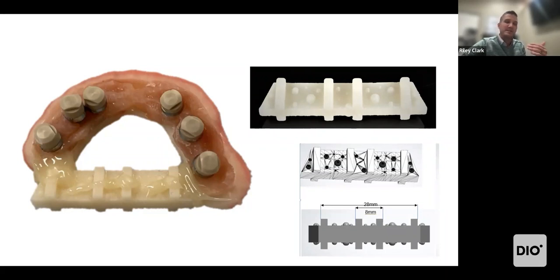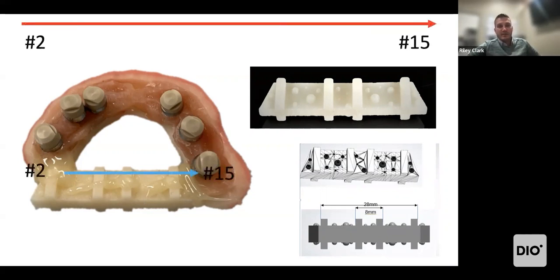So when I talked about solution companies, this is a dental implant company that's helping you scan more accurately so your prosthetic fits more passively. I mean, that's really powerful that an implant company is thinking that far down the workflow. That's not what they do typically. They just want to sell you titanium. So again, 2 to 15, the data chain is a lot shorter, and it's all circular. And I think that creates more, I don't know, I'm not a physicist, that just creates more accuracy with the data. And I found that they fit a lot better using the scanning Lego.